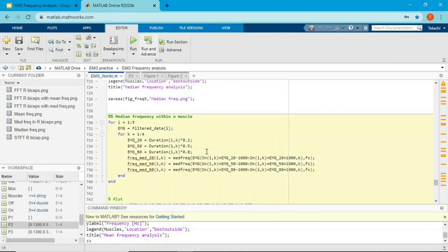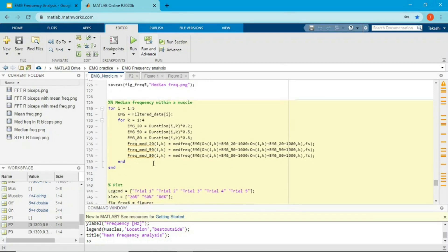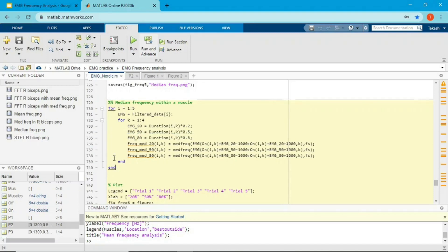I went a bit further and applied the same approach I used for amplitude analysis — finding values at 20%, 50%, and 80% of the entire EMG duration — but now using median frequency instead of amplitude. The code is the same with the variable and function changed, but the principle is identical. If you're unsure about any line, check my previous videos.